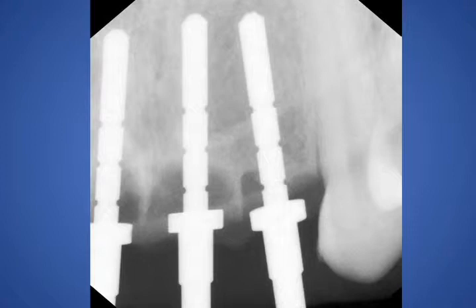A radiograph is taken. We're not coming too close to the natural teeth. The implants are spaced properly. You can see in this radiograph the dimension of the paralleling pin shows that we will have adequate spacing between the implants for ideal healing and integration of the implants.